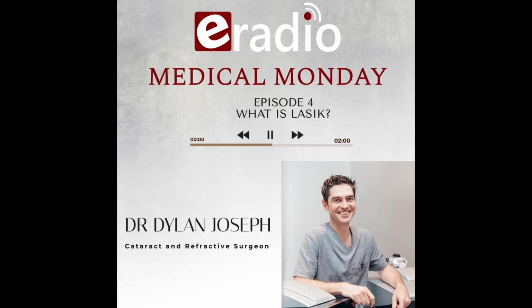Wow. So if you think of the eye, it intrinsically moves. You can follow a target, you can fixate on a target, but when we lie down, the eye actually changes position a little bit. It turns. But these lasers have been developed to be able to track you in the vertical, the horizontal, the oblique axis, and the torsional axis. So if your eye is twisting, theoretically, you could read a book while the laser is delivering its pulses. Wow.